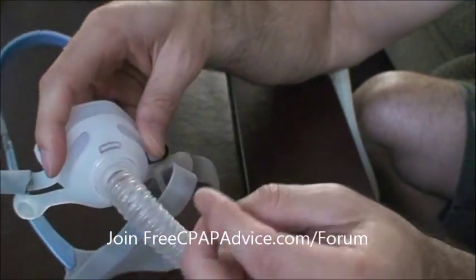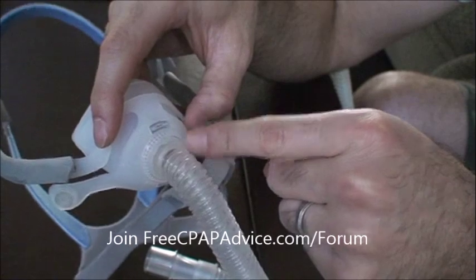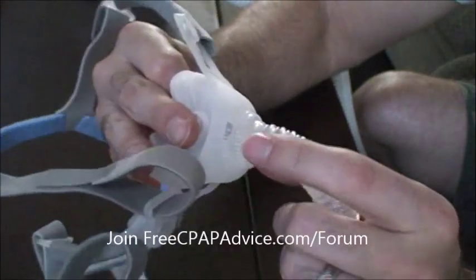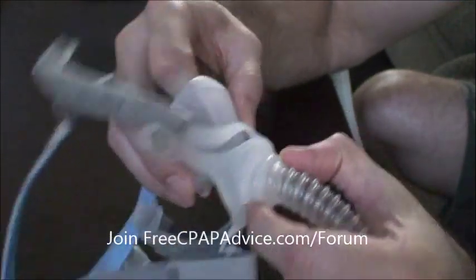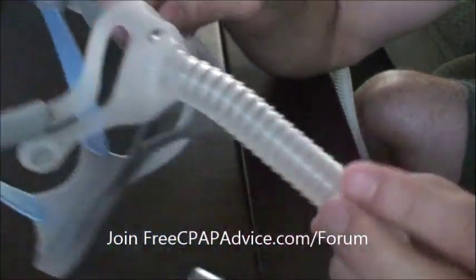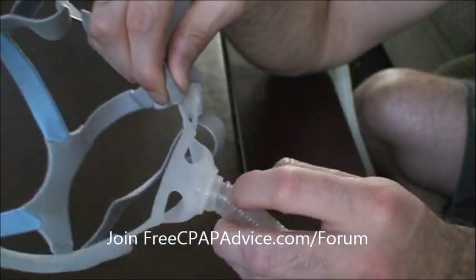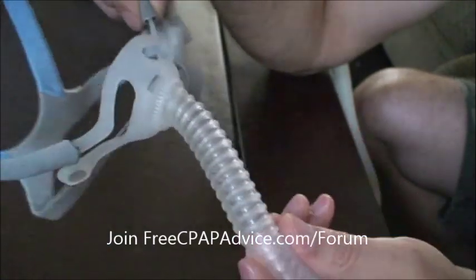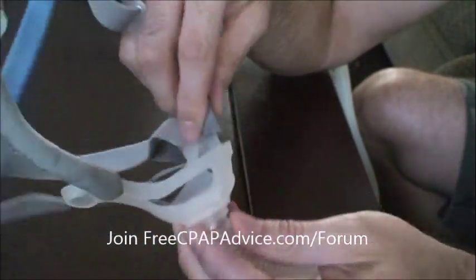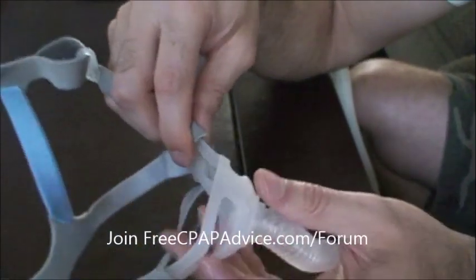One of the things I really cannot stand about this is it has no swivel right here — it's just part of the frame. To get the cushion out, you want to find the tab on the top and the tab on the bottom, pinch, and it comes out. You can put a different size on, wash it, whatever you want. But once you have just the frame, there's no way to get the elbow off. So if you have a frisky cat or you like to fight with your hose at night and you damage this, your whole frame is gone — you'd have to buy a whole new mask.